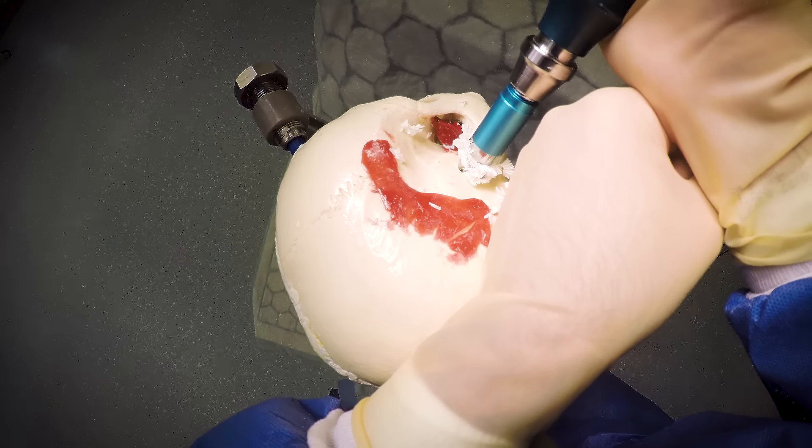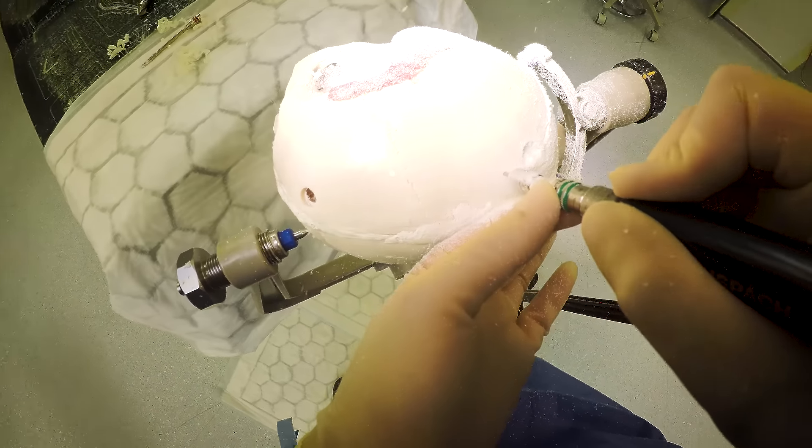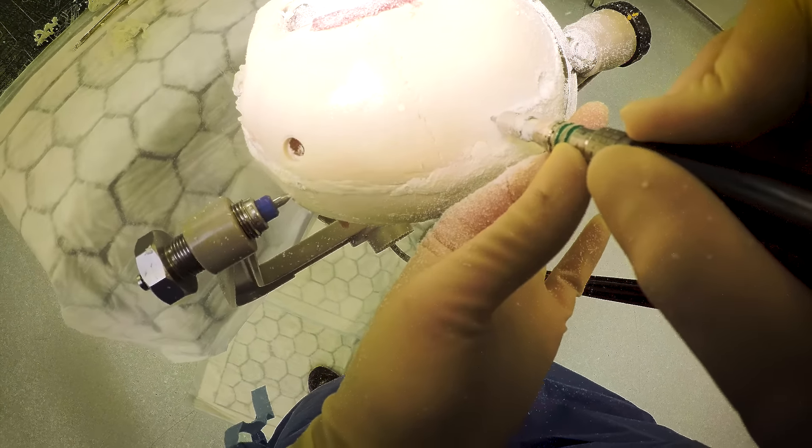I'm going to show you how we use a perforator — that's what we use to make a hole in the skull. I'll also show you how we use a craniotome, which connects those holes so that we can make a large flap of skull and take that off.